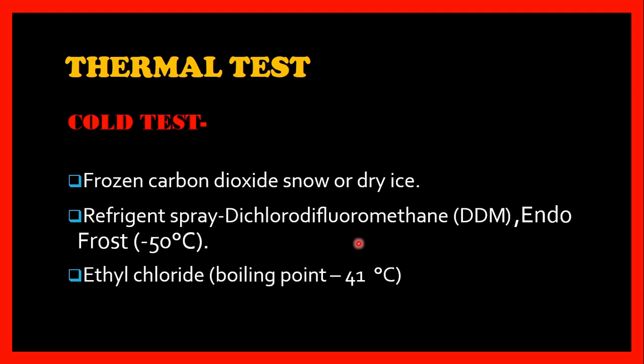Where do we start? The cold test should be started from the posterior-most teeth, advancing to the anterior teeth. Otherwise, ice water can drip in the posterior area, which can affect our result.